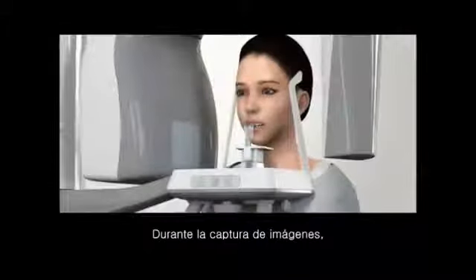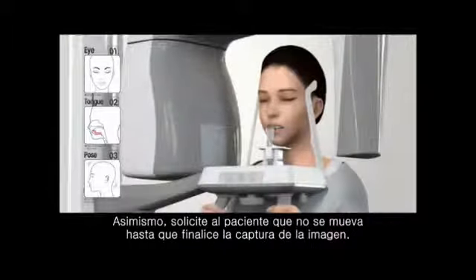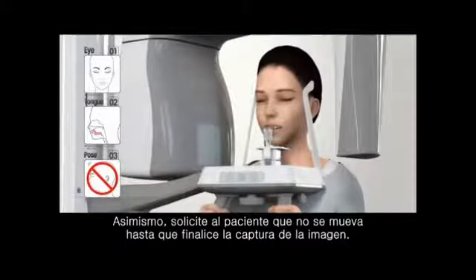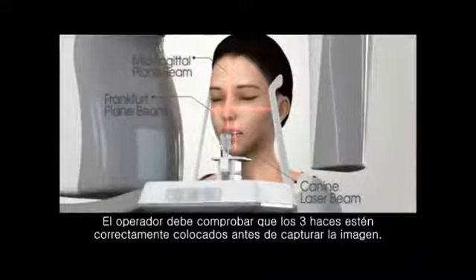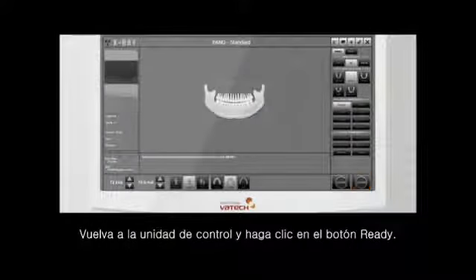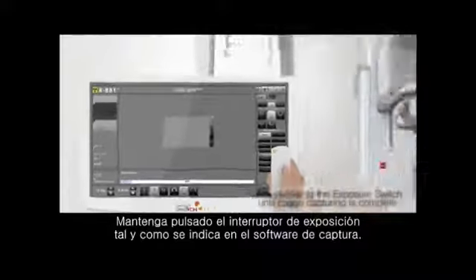During image capturing, ask the patient to close the eyes and place the tongue to the hard palate. Also, instruct the patient not to move until the image capturing is completed. Operator should confirm 3 beams are placed appropriately before capturing the image. Back to the control unit and click the Ready button. Press and hold the exposure switch as the guide in capture software.